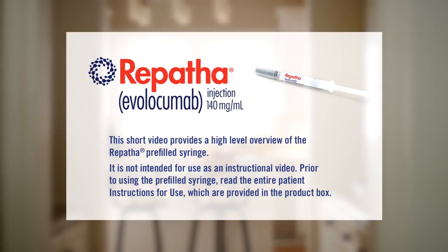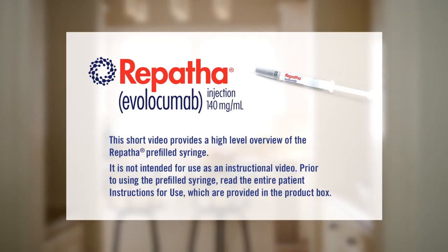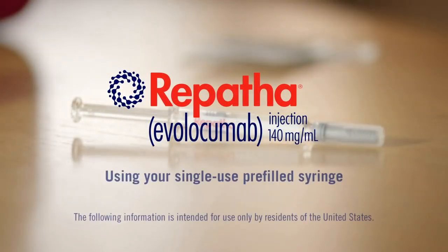This short video provides a high-level overview of the Repatha pre-filled syringe. It is not intended for use as an instructional video. Prior to using the pre-filled syringe, read the entire patient instructions for use, which are provided in the product box. This video shows you how to inject Repatha with a single-use pre-filled syringe — we will call it a syringe for the rest of this video.